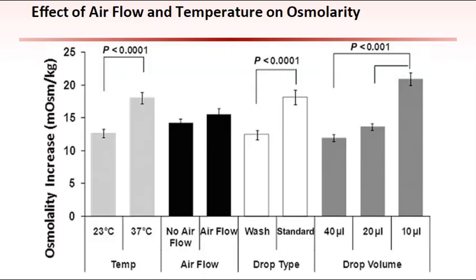Laminar flow hoods are used as a clean place to prepare dishes for use in IVF. There are always questions about whether to have the heated surface and/or the air turned on when preparing dishes. A report from Swain and colleagues in 2012 showed that preparing dishes on a heated surface and with the laminar flow turned on in the hood at the time of the dish preparation resulted in higher osmolarity in the droplets of media. Higher osmolarity translated into poorer embryo development in a mouse model.